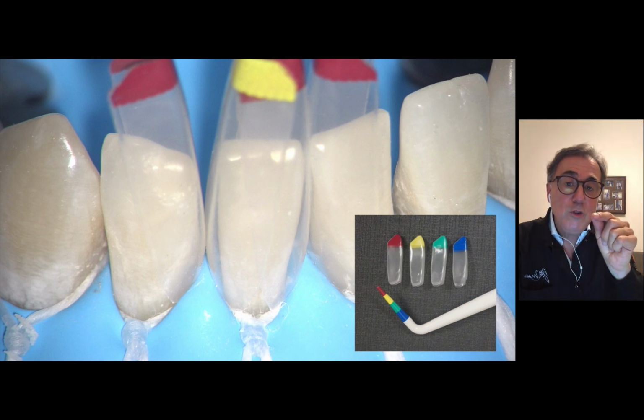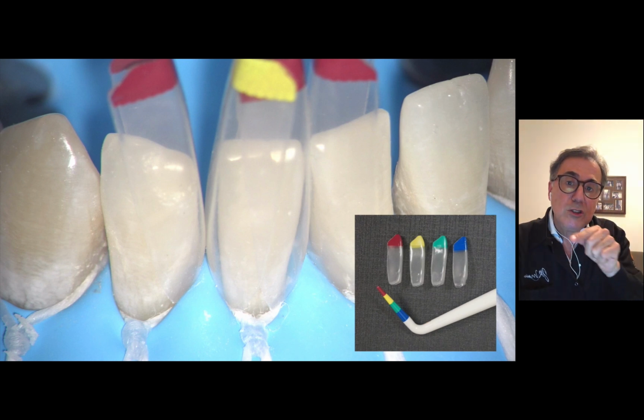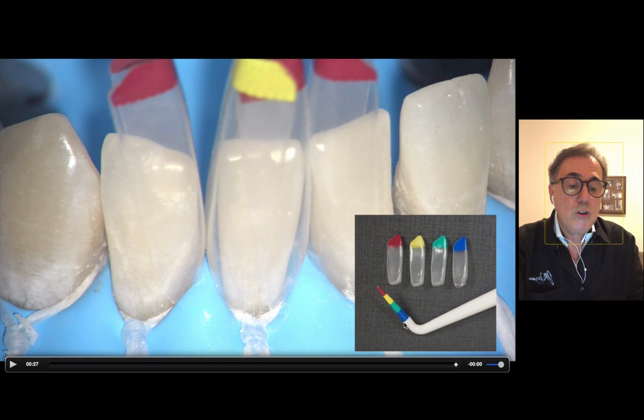Once you stick that probe in those spaces, depending on how much it penetrates in the space between the two teeth, you're going to have a color that's coordinated with the color that you have for your matrices. So if you have a large space, your probe will go all the way up here, and then you're going to use the blue matrix. It's pretty simple. And if you have a very small space, you're going to use the red matrix.